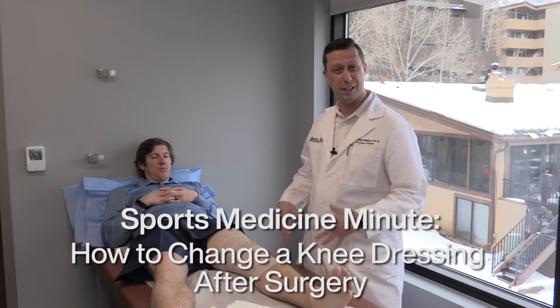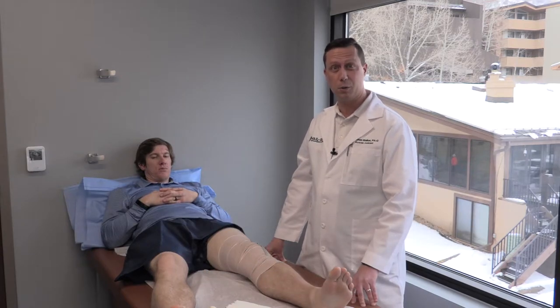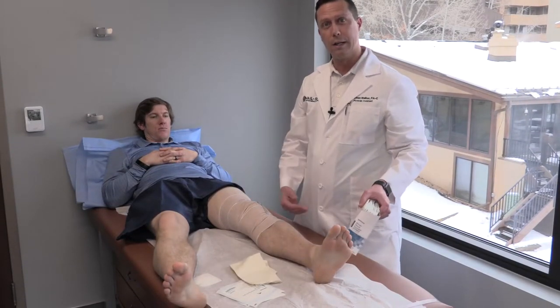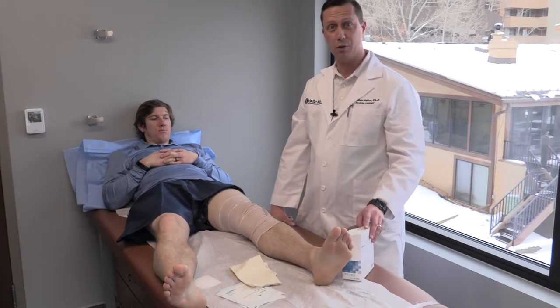A lot of times we try to see our patients after surgery and PT, but that doesn't always work out for everybody. So if we sent you home with a little bag of dressing change materials, we'll walk you through now what that's going to look like doing the day after surgery.